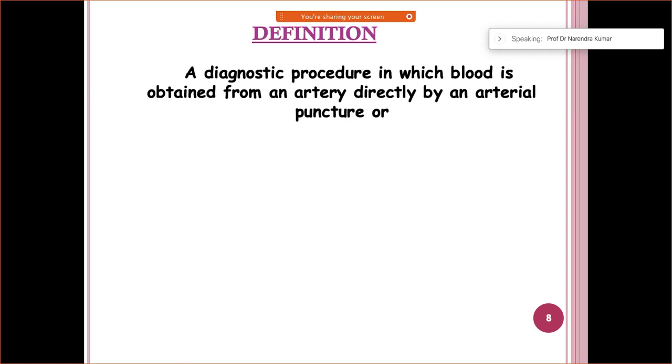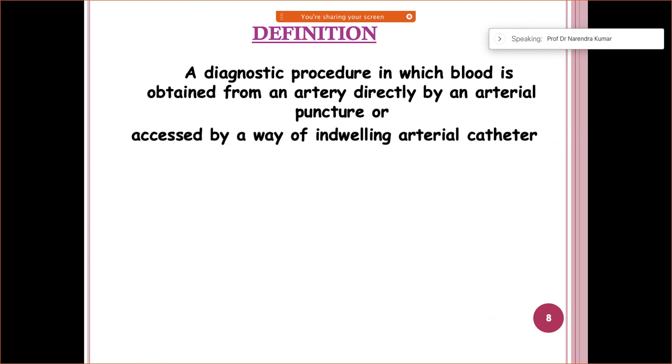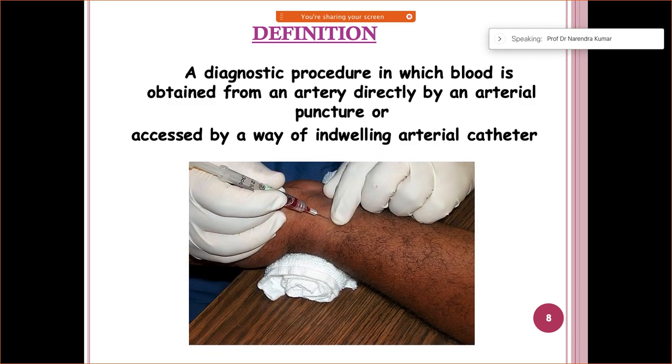So, what is the definition? This is the test in which blood is obtained, of course, from the artery directly by an arterial puncture, or otherwise even from an indwelling arterial catheter.